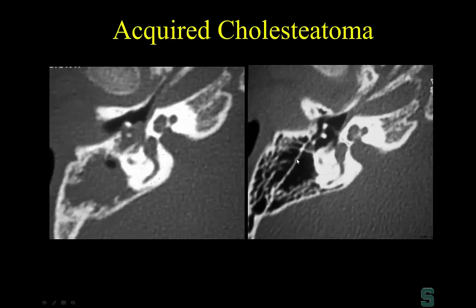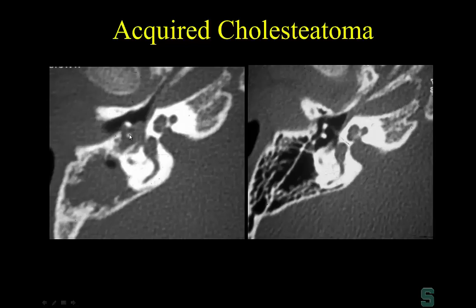Another example of cholesteatoma with a large mass and erosion of Körner's septum along with the fine labyrinthine bone. The earliest sign of cholesteatoma may be demineralization of the long process of the incus. I'd caution against relying on scutal erosion as a primary finding — scutum erosion is a very late finding. I suspect scutum erosion became associated with cholesteatoma because it was reliably seen on conventional tomography. With CT, we can detect ossicular erosion much earlier than scutal erosion.